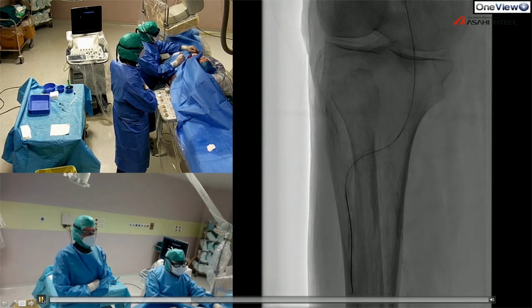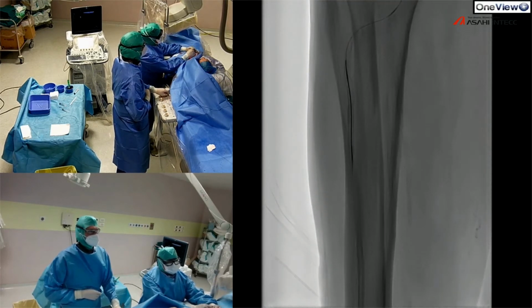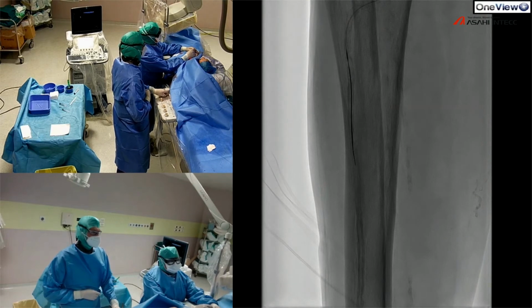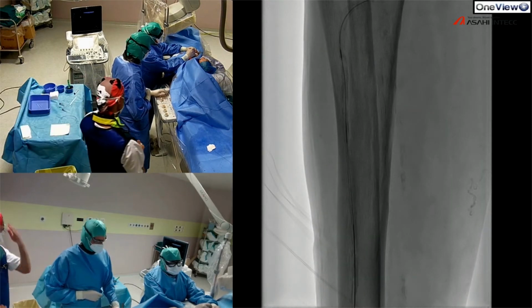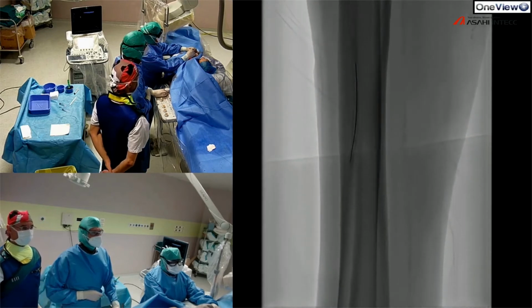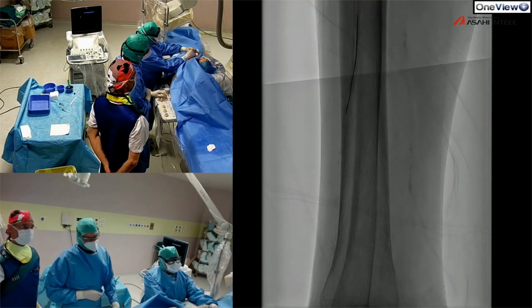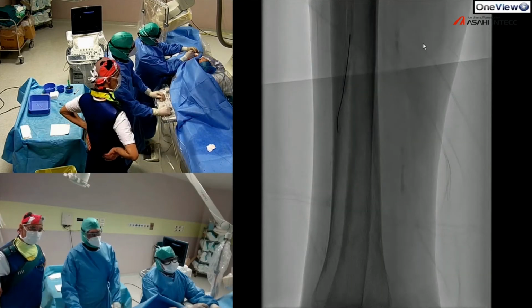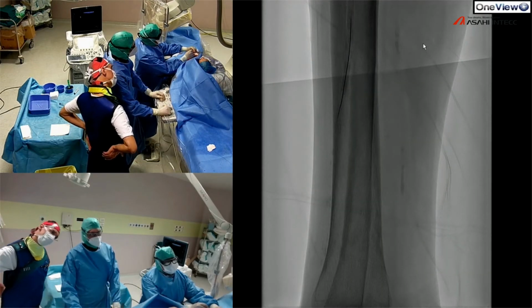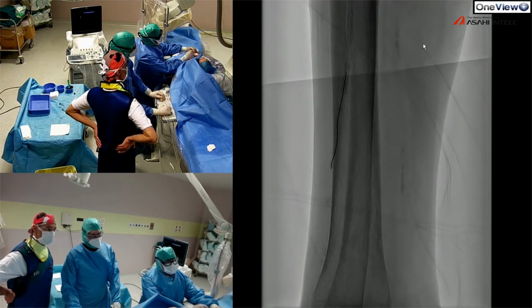Have you seen the wire could approach the curve of the anterior with very, very few difficulties. So this is a good aspect because it can navigate, in most cases, and look how easy it is going in the middle of the calcified vessel. Now there are some difficult and challenging passages. Again, we have to drive the wire and try to maintain the tip in the middle.